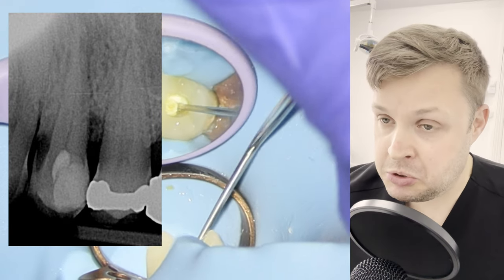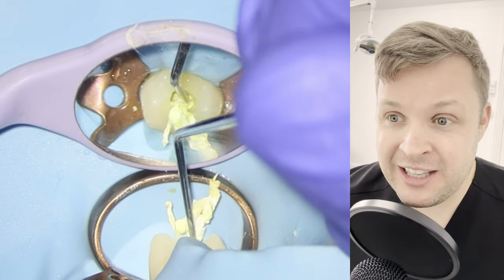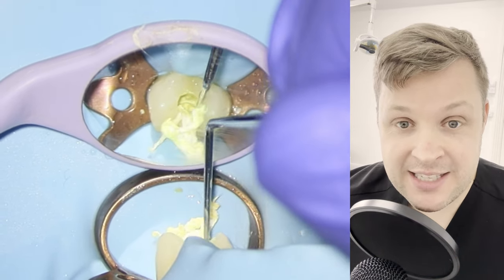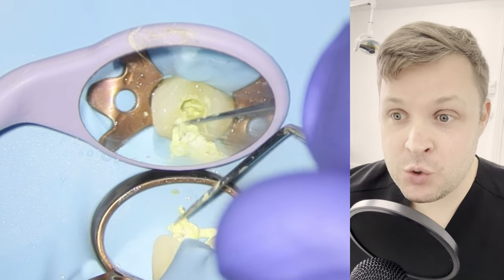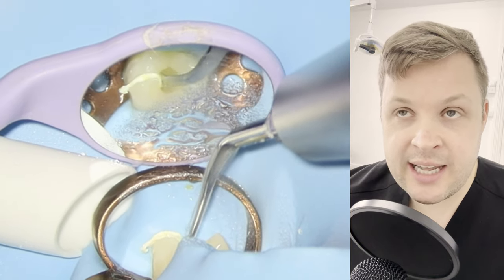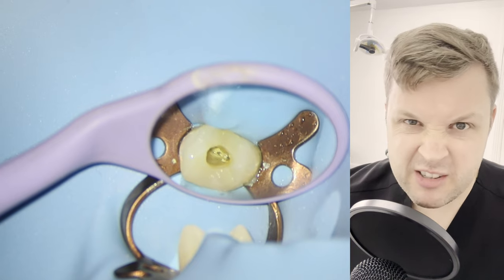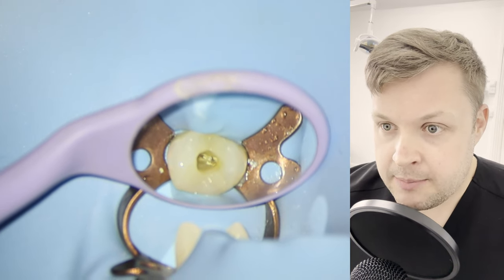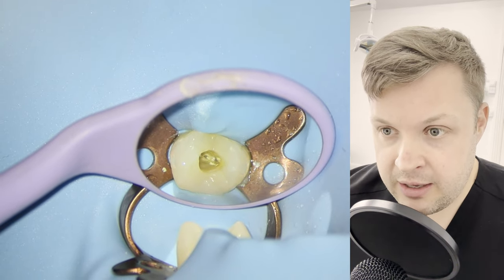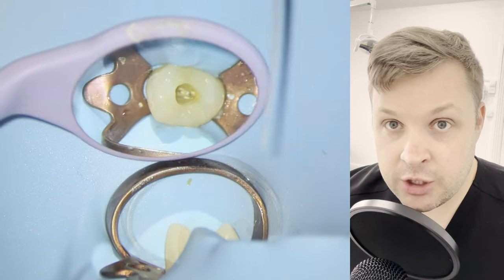I think it was me — I'll have to check the notes. I think it's me because I've used PTFE tape here to dress the tooth, which I think is a really useful way of dressing the tooth. If you use a cotton wool pledget, it just gets mixed in with all of the temporary filling material, so it's really difficult to get out. So I think if I accessed this tooth, I haven't really gone looking for the canals.